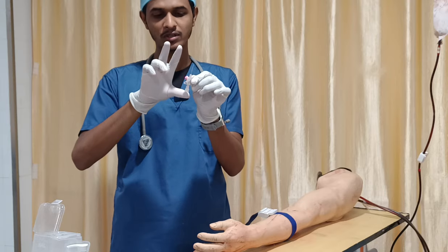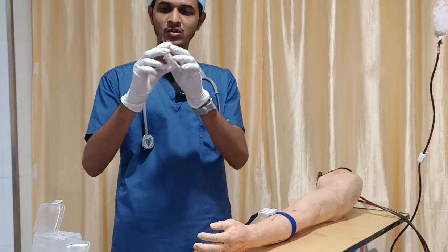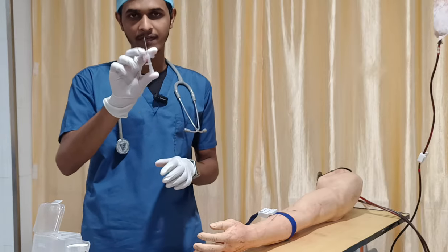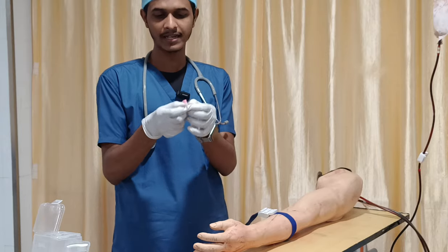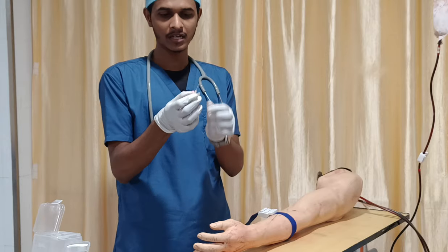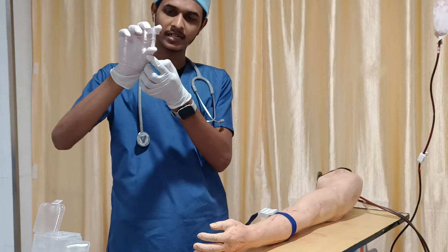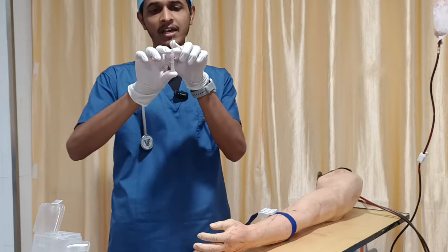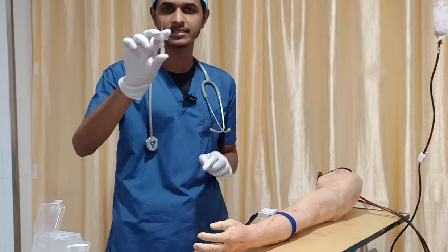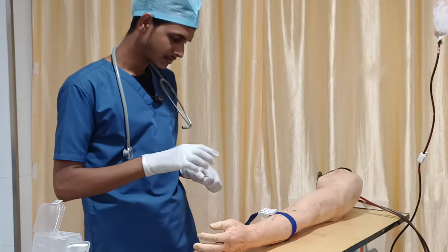Your thumb should rest over the back side of the hub, the distal portion of your catheter, and your two fingers rest over the butterfly wings. This is the way you have to hold your catheter, not like this or like that. This is the way you have to insert.